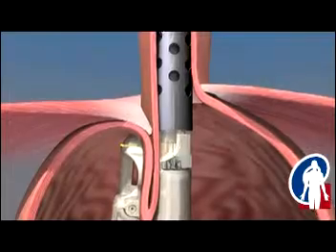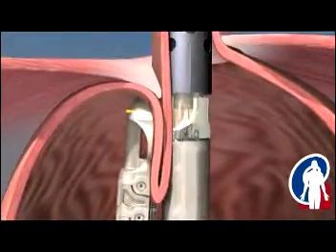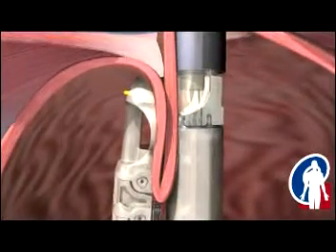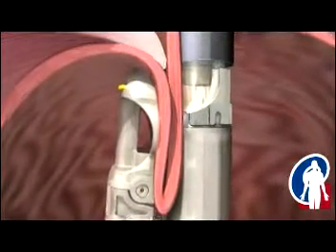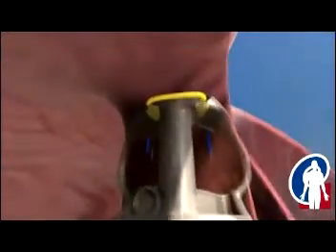The Esophyx device is then rotated, wrapping the fundus toward the lesser curvature of the stomach. Under visual control, the Esophyx device is then used to deploy two H-shaped fasteners to hold the fold of tissue in place and maintain the wrap.